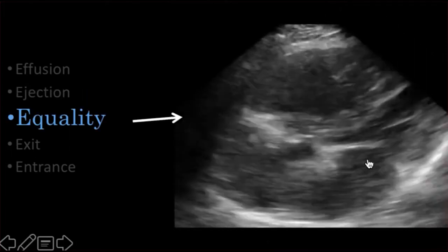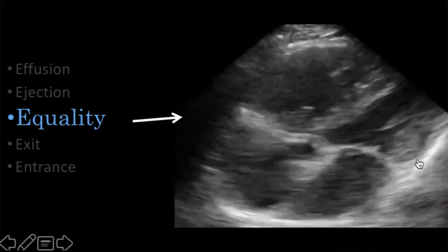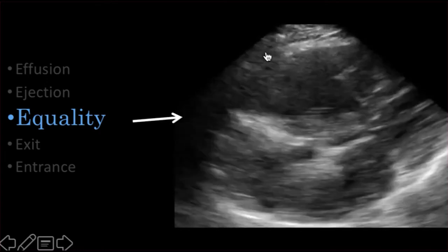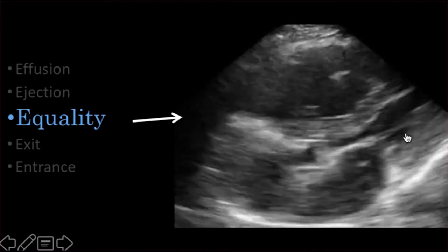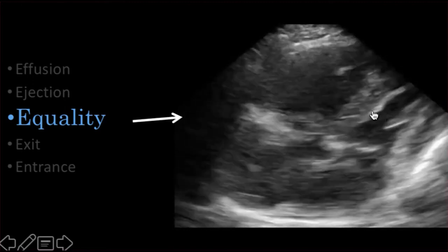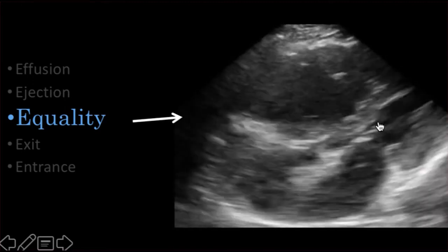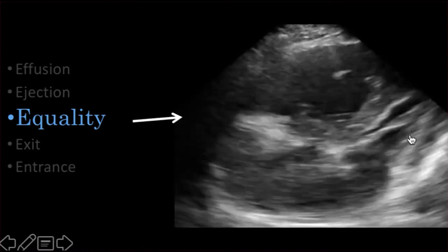The next E stands for equality, specifically looking at the right side of the heart versus the left side of the heart. In this view, the right side of the heart is greatly increased in size compared to the left side, which the left side should always be bigger. The normal adult ratio of right versus left is 0.6 to 1. To increase specificity, we talk about a 1-to-1 ratio as our cutoff.